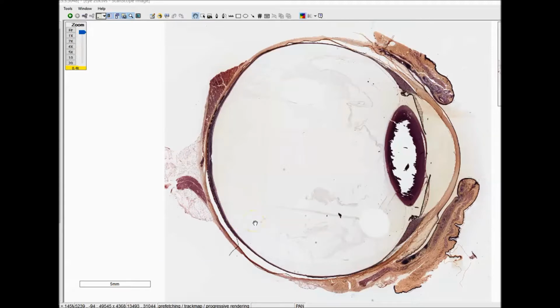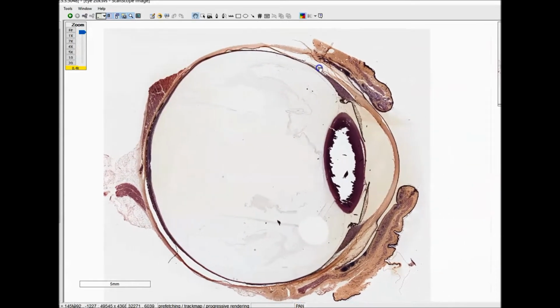This specimen really doesn't have much morphological detail up at 40x because you just can't get past 20. It was scanned lower. But it does allow us to see some of the overview features and a couple of structures that aren't in some of the other specimens that we've got. So first, let's look at things like the chambers of the eye. Let's review those. The chambers are three.